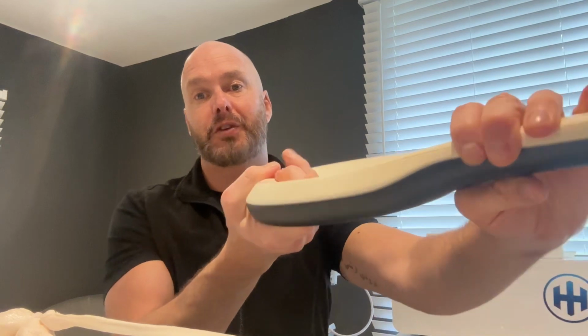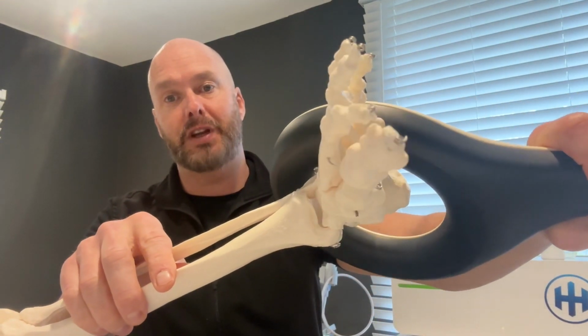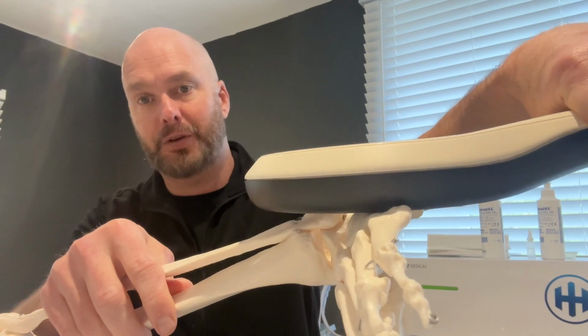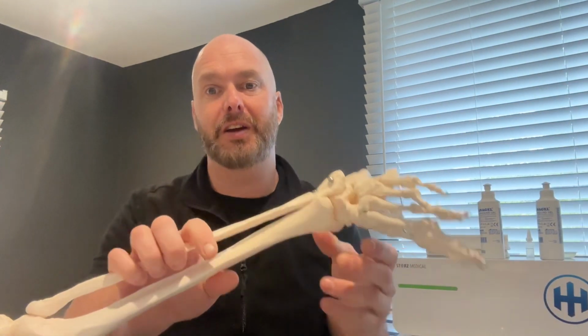Now, if we were to look at those of you that have got the EMTT, that fits nicely over the ankle. The greatest energy, I believe, is at the edge here, so you want to really try and get the EMTT sitting right across that part of the ankle. I don't know how well you're seeing that on the video, but you want the EMTT to be cupping that distal end of the fibula, that lateral malleolus, and sitting tight onto there. However you position your patient, I tend to have the patient face down, lying prone, and we slot the EMTT just over the ankle that way, and then we can cup it nice and tight against that lateral malleolus.